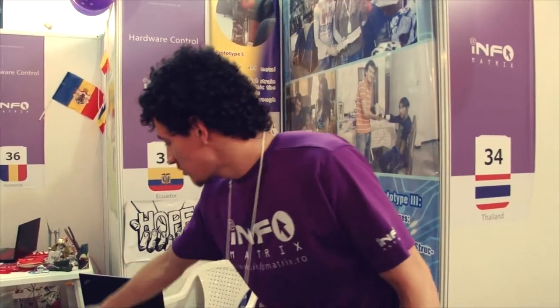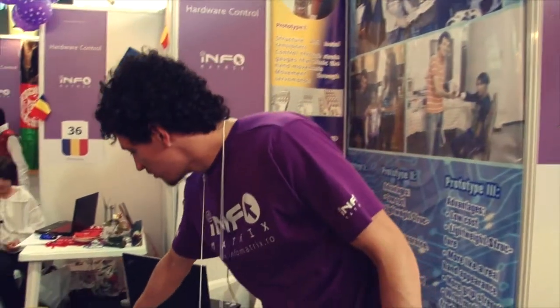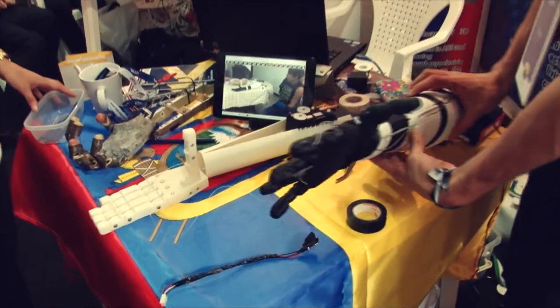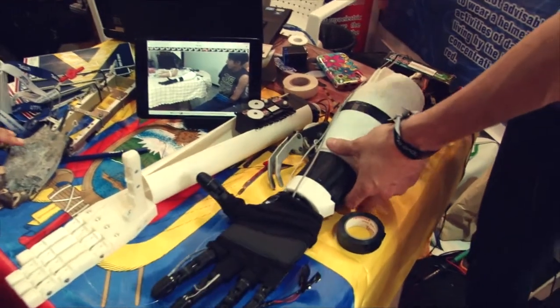In this project, there are prototypes on this table. This is the first prototype, the second, and there are four prototypes in this edition.